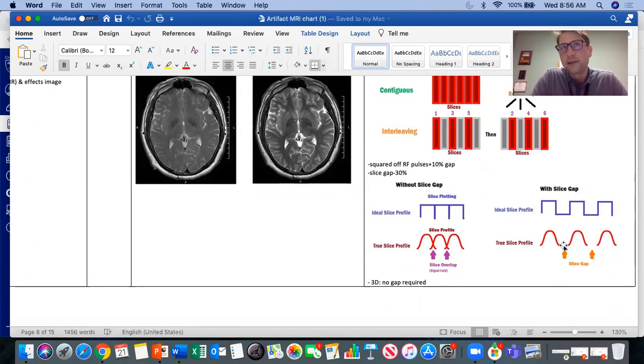And the only potential pathology that would be that small sometimes is a metastatic brain cancer, where there's a very small lesion that could potentially grow into a bigger lesion as that cancer progresses.